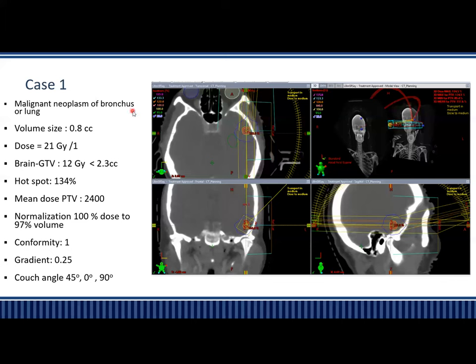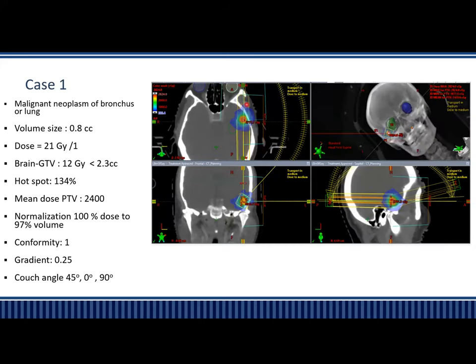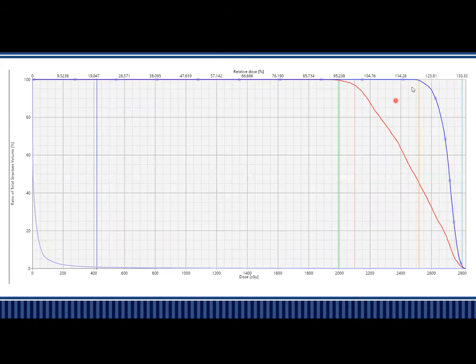Case one is a malignant neoplasm of bronchus or lung. A very small volume of 0.8 cc was treated, and we gave a dose of 21 Gy in one fraction. Full coverage was achieved. You can appreciate the coverage and the fall-off of the dose — it's around 28% of 21 Gy, which is very low, indicating good confinement. Three arcs were used: two non-coplanar fields and one coplanar arc. The brain minus GTV was verified by the clinician at 2.3 cc. Hotspot is 134%, mean dose of PTV is 24 Gy, normalization is done according to ICRU guidelines. Conformity index is 1 and gradient is 0.25, which should be less than 0.3.